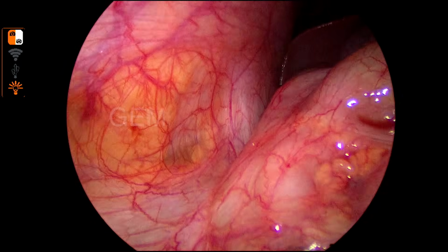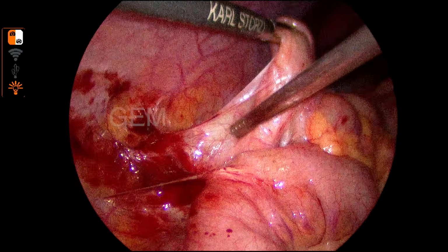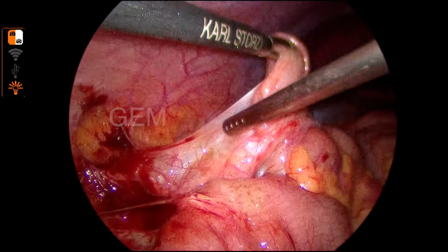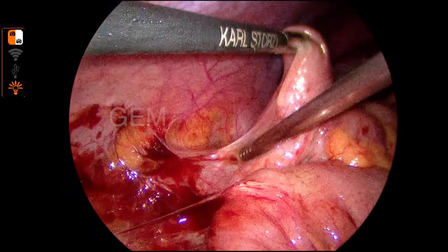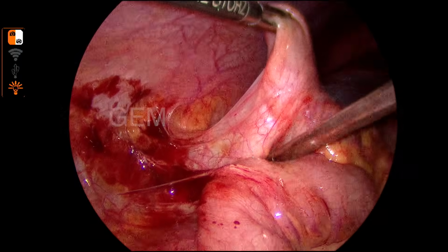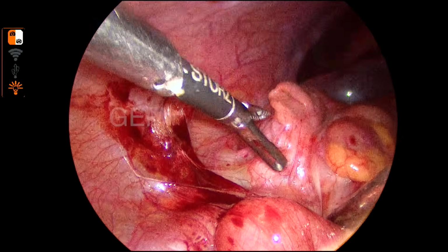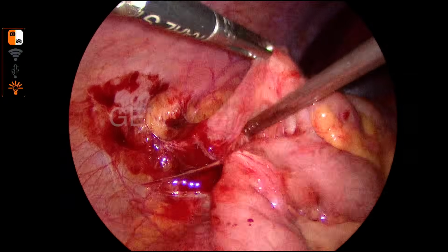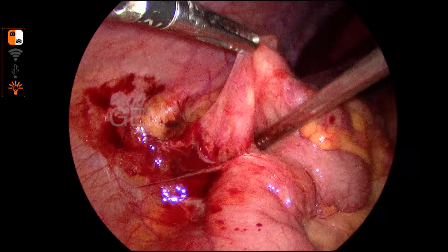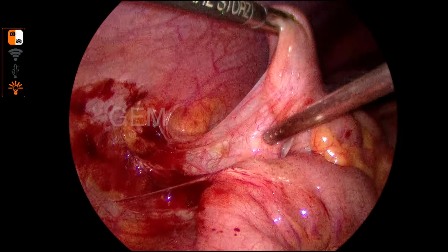So usually we have to hold the ileum, and then you can mobilize. So now he's holding the ileum, so that is better. And always, this is not a place for suction dissection. Only for inflamed adhesions in infection do we use the suction, not on the developmental adhesion site. So in this case, there is no subcecal, no retroileal, no pelvic, no paracolic. That means it should be retrocecal only.